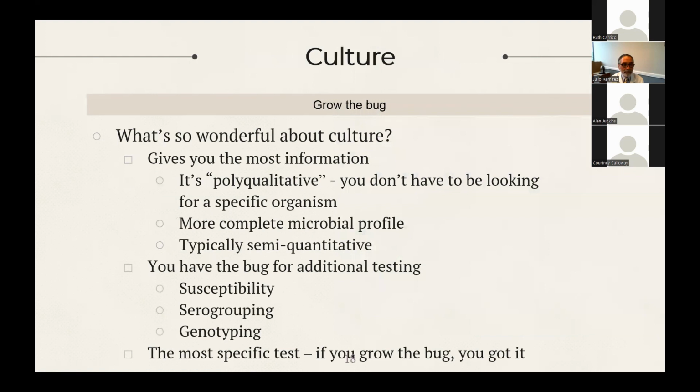So let's get to culture. Culture, we're going to grow the bug. Culture is what we do most of the time here in micro. What's so wonderful about it? It gives you the most information of anything else.